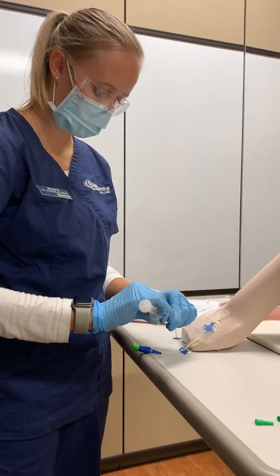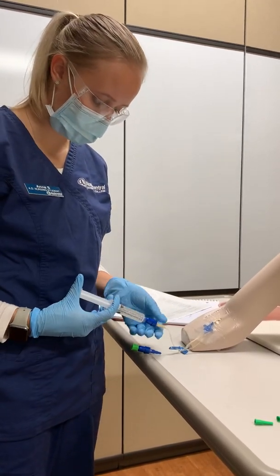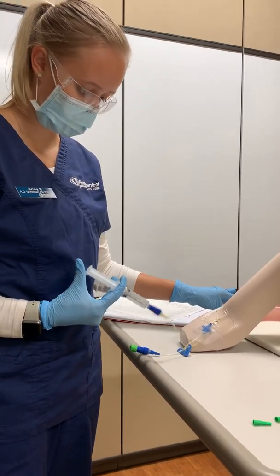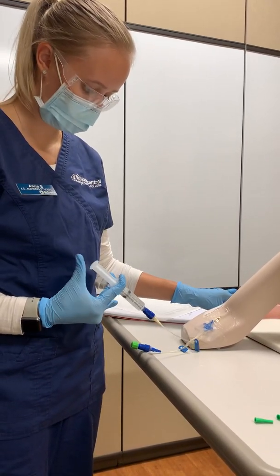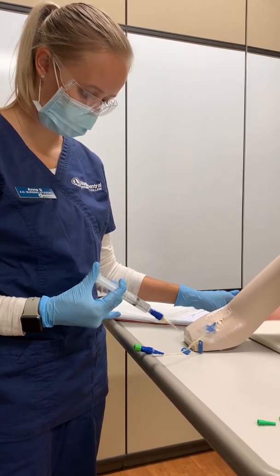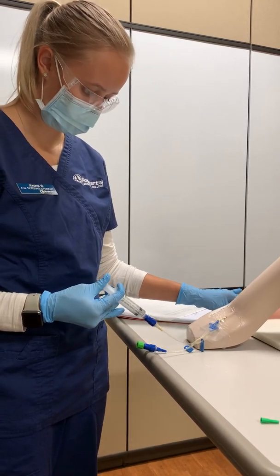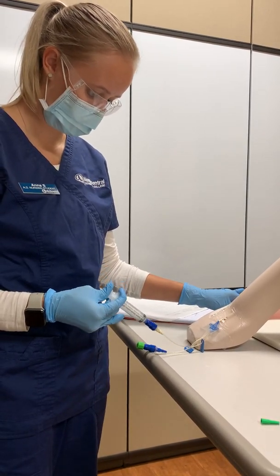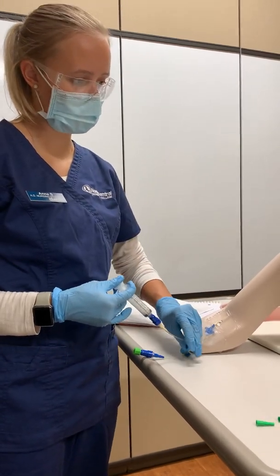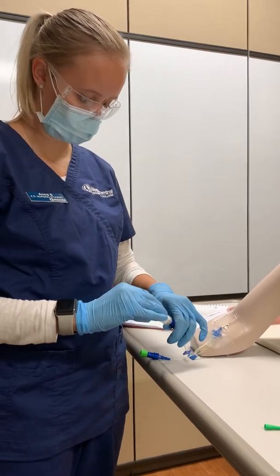And then this last one, I would pulsate it about 1 milliliter each time. As I'm giving the medication and following the medication, I'd be watching for any adverse reactions to it.